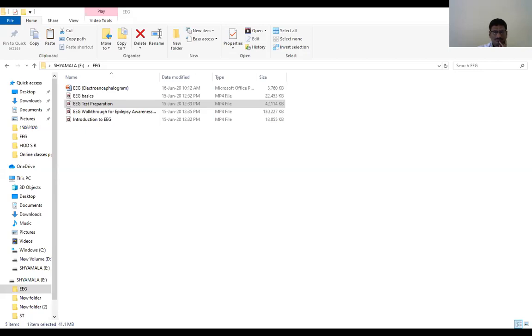These electrodes are plugged into a jack box that has a cable attached to the computer. In looking at EEG patterns, we compare the left side of the brain to the right side, so these electrodes must be placed very precisely. The application can take between 30 and 40 minutes.